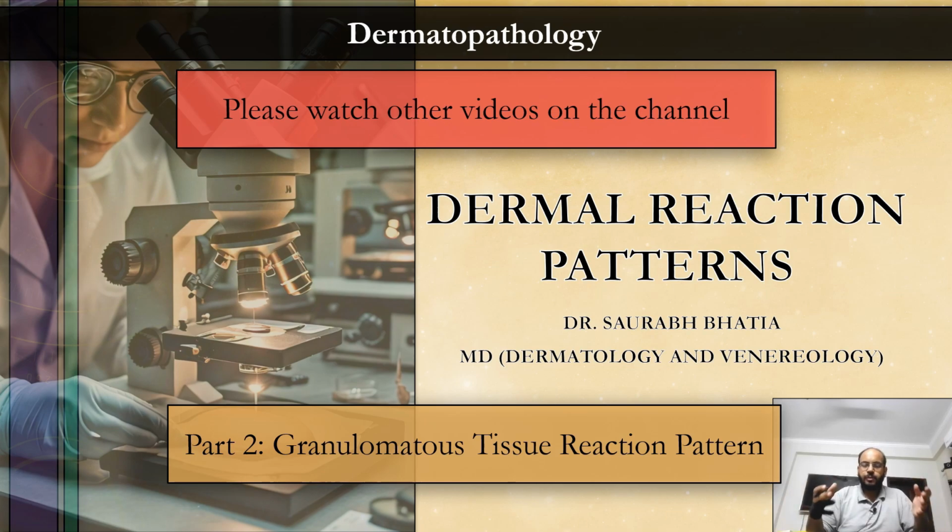Okay, since this reaction pattern is predominantly situated in the dermal portion of the slide, nearly everything is happening in the dermis. But we have to take into account the changes that we see in the epidermis in order to make a complete diagnosis. But the extent of this lecture would be just to find out how we can identify different types of granulomas and different types of reactions that we see in the dermis while we're analyzing a slide in which we see this type of tissue reaction pattern. Okay, so slowly we'll study the different granulomas, and without much further ado, we'll start our discussion on the granulomatous tissue reaction pattern.